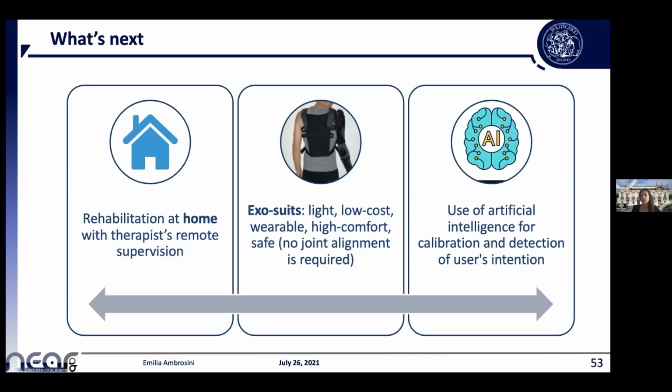Currently we have seen that hybrid robotic systems are promising from a therapeutical point of view, but at the current stage, they are just one on top of the other, both in terms of control system and in terms of hardware.